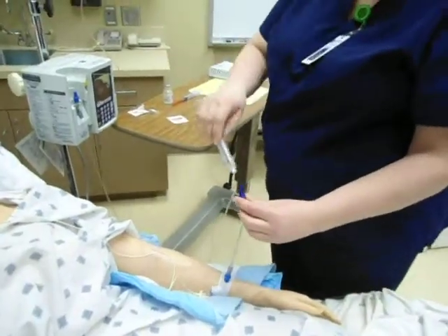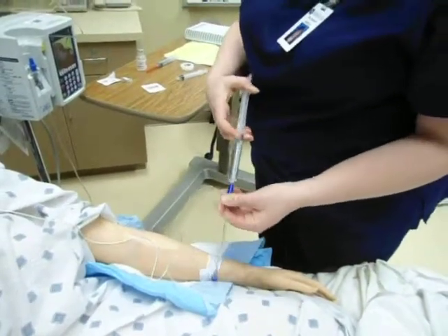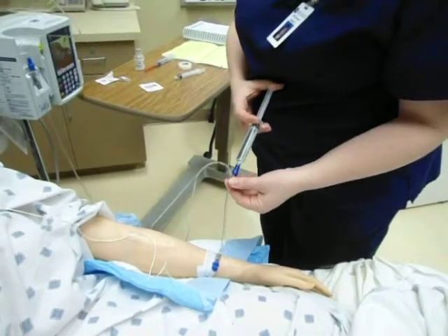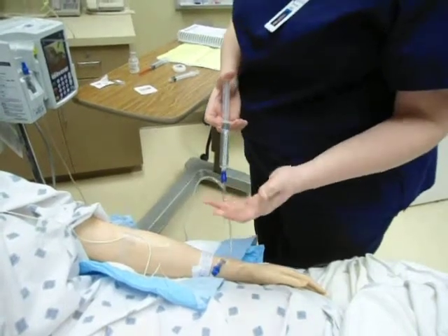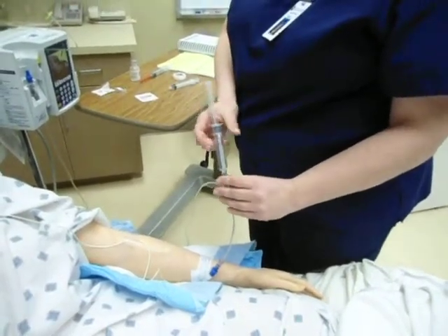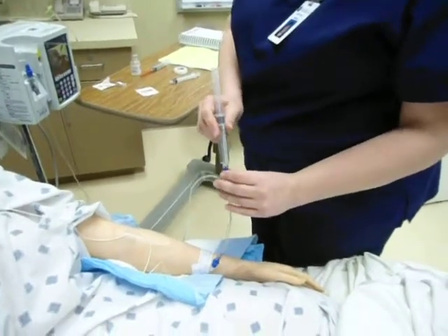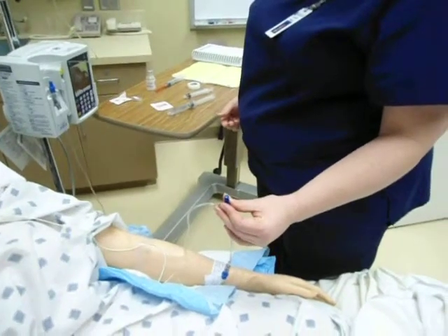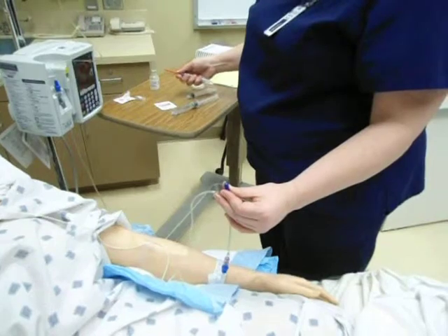I'm going to take my normal saline, and I'm going to flush this line so that I get that medication out. I'm going to go ahead and flush 2 to 3 mils, and I'm actually not going to do it right now because I don't know if it's going to go on the floor because it's not hooked up. But I would flush 2 to 3 mils, take it off, make sure I keep this so that it's still clean and ready for the medication.